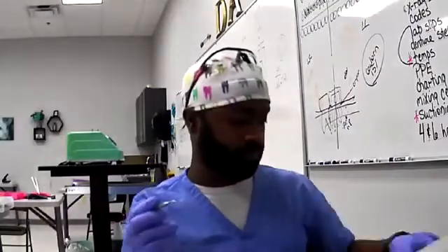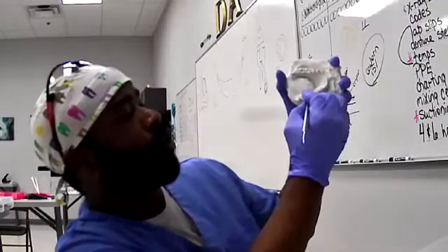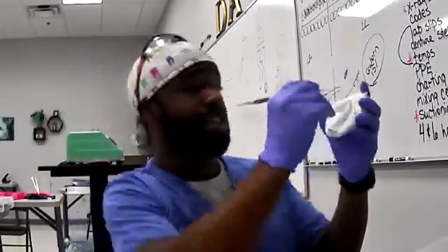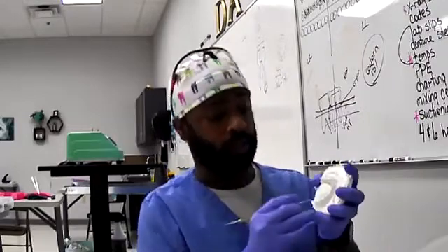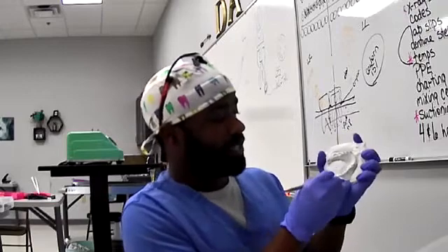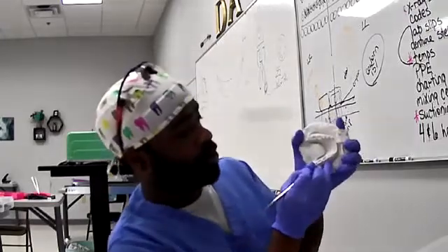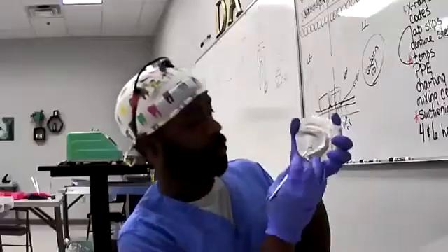Use the sharp part, being that you want to get into every groove of the tooth because you're not just going to pack it and leave it flat. You want to shape it like an actual tooth. So you would literally have to go through, scrape out the excess. You'd have to dig your own little grooves. You have to go in between the two. Everything up good.